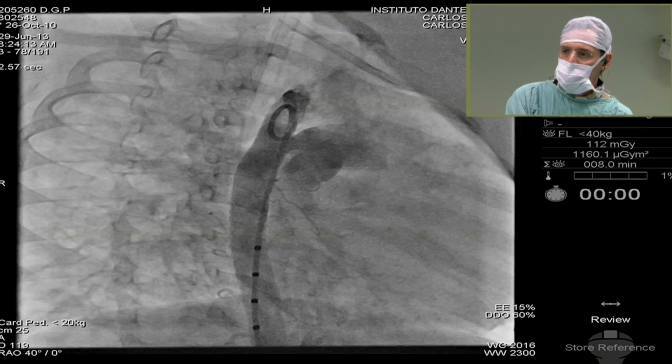So there are a couple of questions. Let's try this device. Let me show the device first. Okay, Franz, now, can we show the device? All right, Franz, do you want to ask your question? We'll then transmit it to Carlos when we link up.